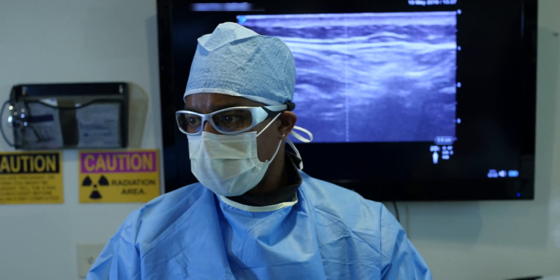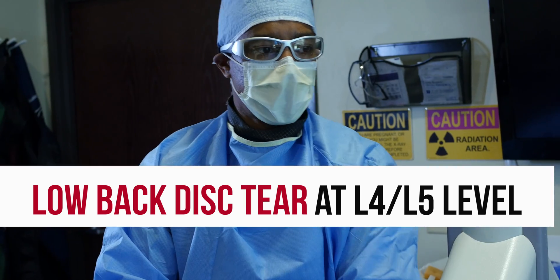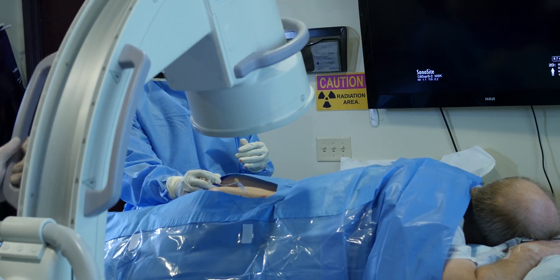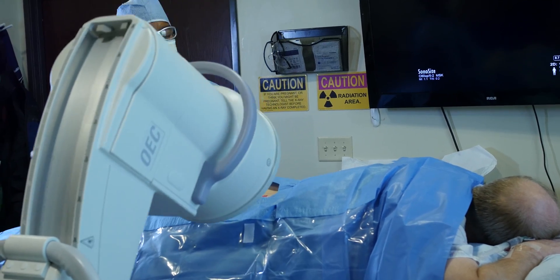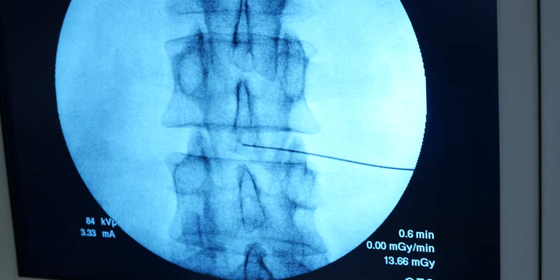Today we'll be treating a patient with low back pain. He actually has a tear in the disc at the L4-5 level, so we'll be treating inside of the disc at that tear. What separates us from other stem cell providers performing intradiscal treatments is our ability to customize treatment for every patient.